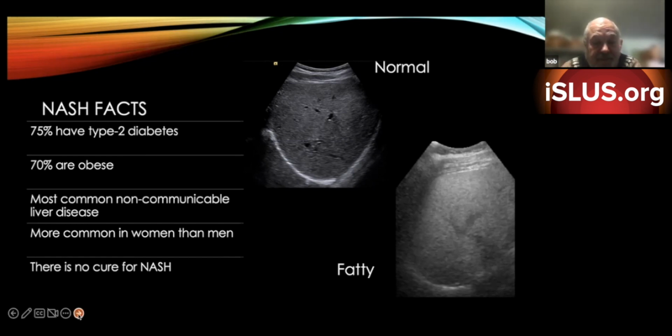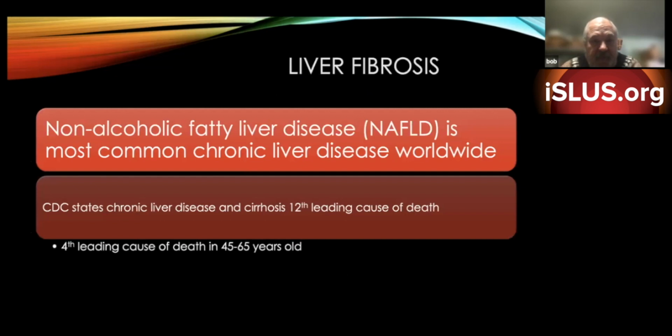Great question. And that's why we're so excited about elastography, because now we can be more precise. We don't have to say mild to moderate or moderate to severe. We can look at these values and pinpoint more where the stage of liver fatty infiltration is. Has it gone into NASH yet? By looking at these numbers. So I think that's what's exciting to me. We're able to give our patients and physicians more information so they can treat their patient better.